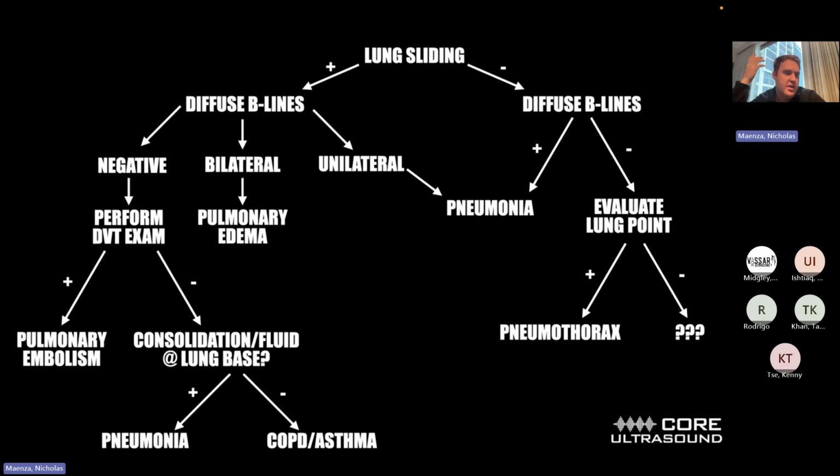It's just that performing a true pulmonary ultrasound, not even just the 3-point one where you're looking anterior, lateral, and lateral inferior, but one where the patient's sitting up and you're doing a 12-point exam, 6 points on each side, takes time. So that's why it's not always done. But honestly, if you're concerned for pneumonia and you're not seeing it on X-ray, feel free to do ultrasound and use the ultrasound as your definitive diagnostic to give your diagnosis for sure. Okay, thank you.